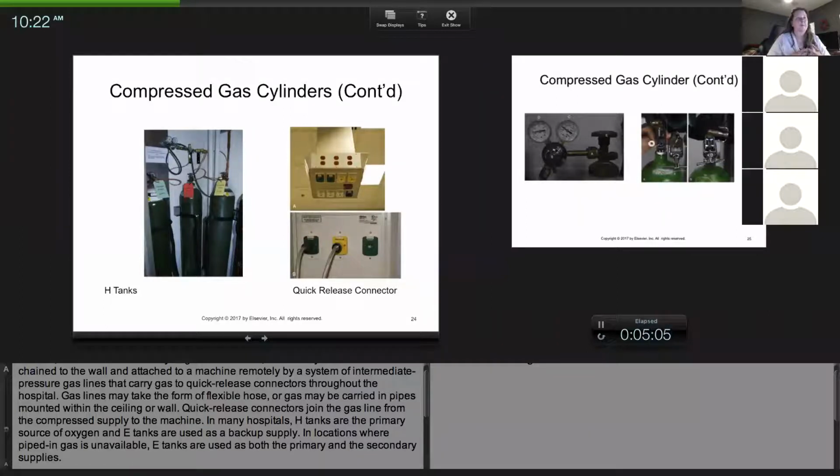Well, what happens, Haley, is technically you cannot completely take them off, but you can turn off one tank and turn on the other. That's the way we have the machines at school. But yes, if you were to take one off, you would have to completely turn off the flow meter. So there would be a time where oxygen wasn't going to your animal. But you can turn one off and turn the other one on.